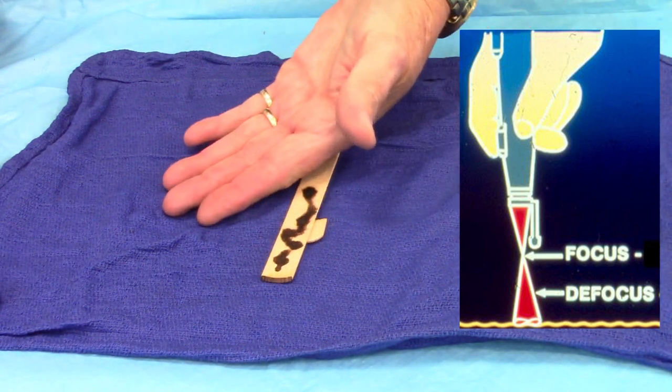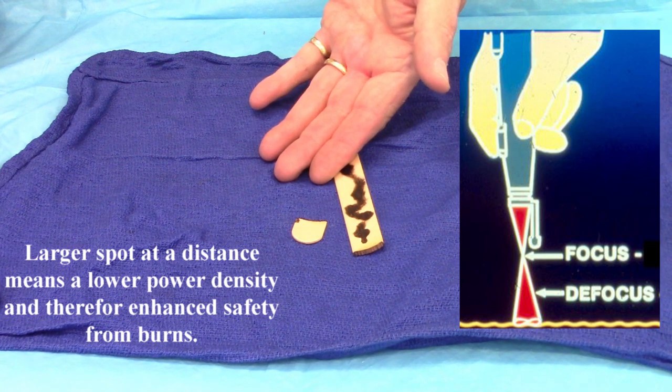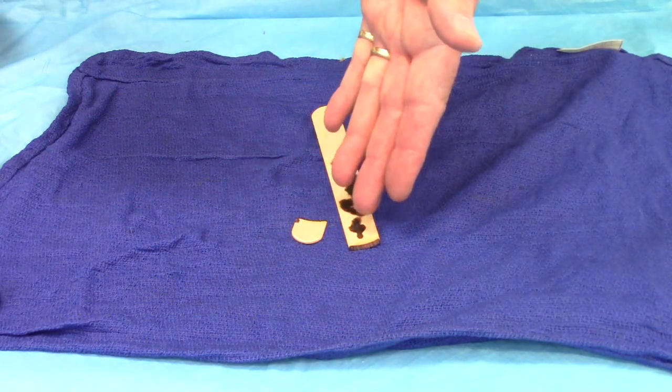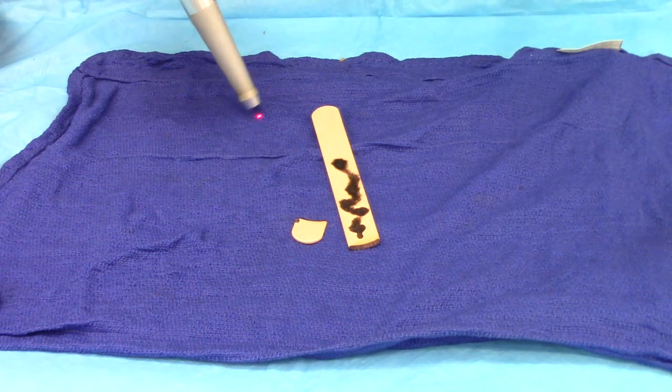Now there comes a point, if I do this on my hand at a distance far away, there comes a point where I can feel the heat but it's not burning me. The farther away you get, the bigger the spot, the lower the power density, the safer it is in terms of burning something.